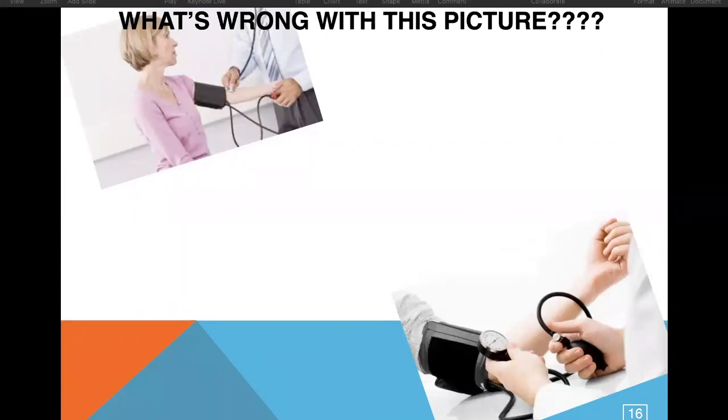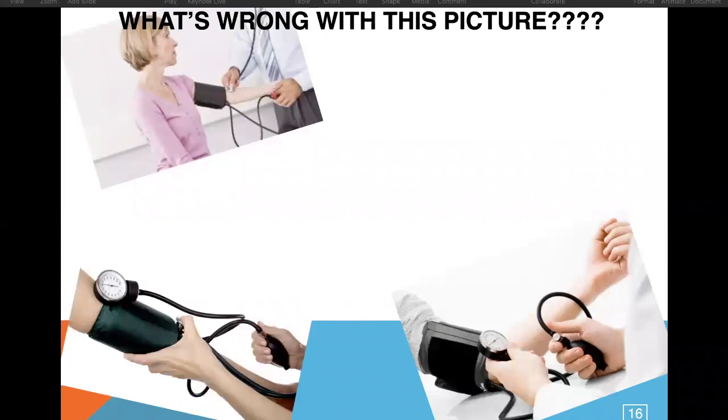And again, here, that arm isn't supported. They're actually almost flexed, holding their arm up in the air, and it's definitely going to increase that systolic pressure. So in this case, the arm is supported, but it's almost hyperextended. It's completely straight, and we'd like to have a little bend in that arm. One trick that some providers will do is to actually take the patient's hand and tuck it in their armpit so they can support the hand while supporting the elbow as well in a slightly bent angle.